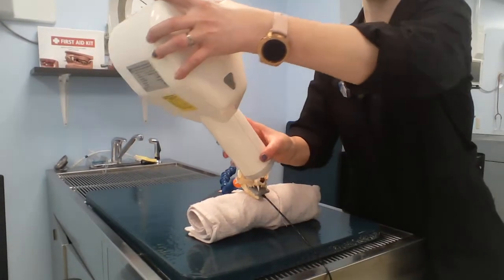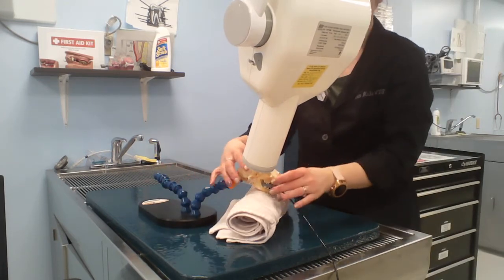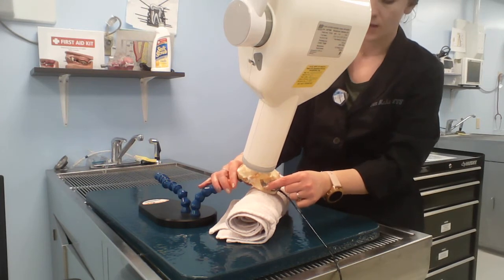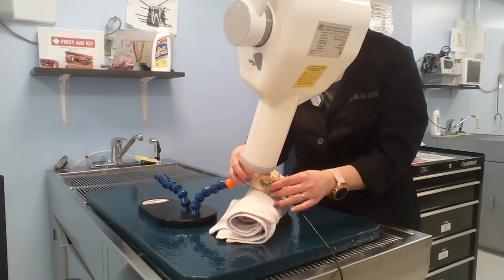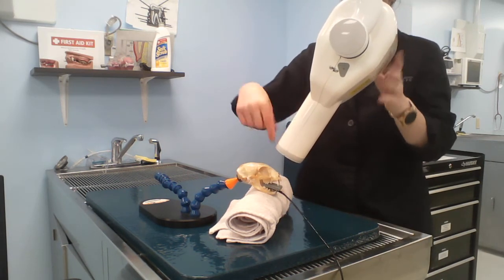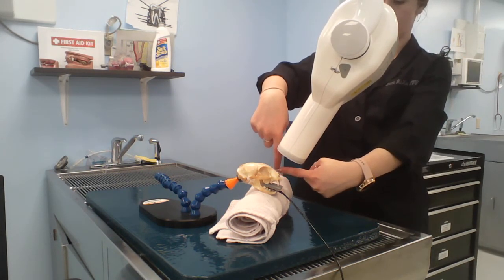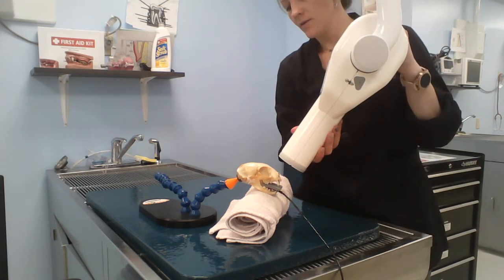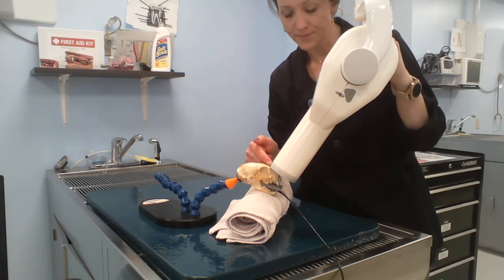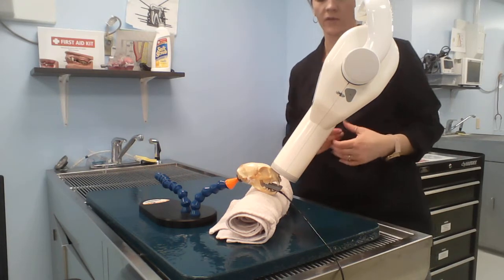Now we're going to do an x-ray of the front canines and incisors. Keeping the sensor in there, you want to straighten it up so that it's square in the mouth and it's out in front of the incisors just a tiny bit. Moving your beam to the front, finding your angle, looking down at the sensor, in at your teeth, and finding that 45-degree angle. Then center it over the nose. There's a notch in the center of this little cone. I like to line that up with the midline of the cat's head, and that ensures that it's a straight-on view.